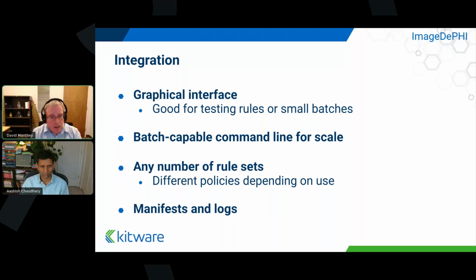And then, as I mentioned, we do write out this manifest file when we do the redaction, and the command line does produce logs to different verbosities as you need it. And that's fine, and you end up with that.